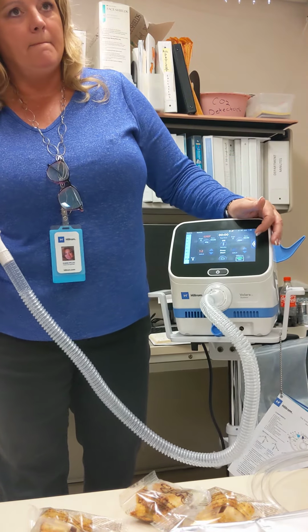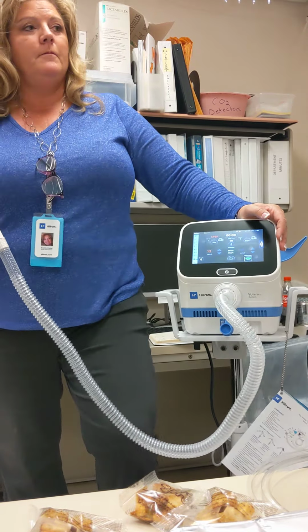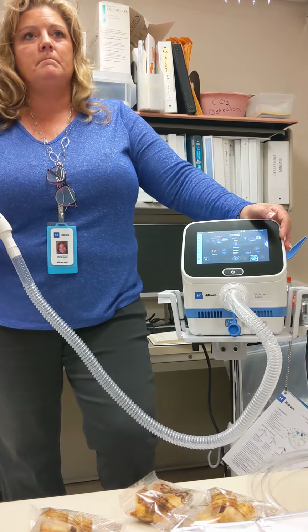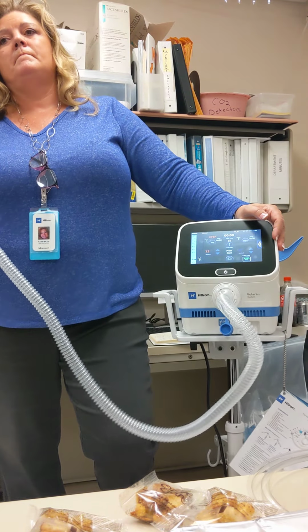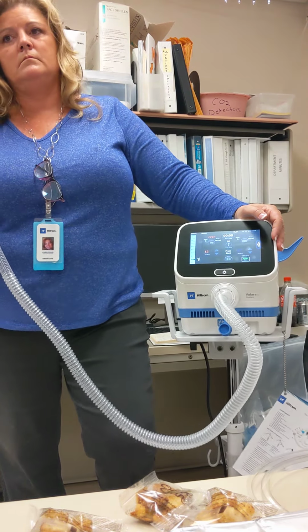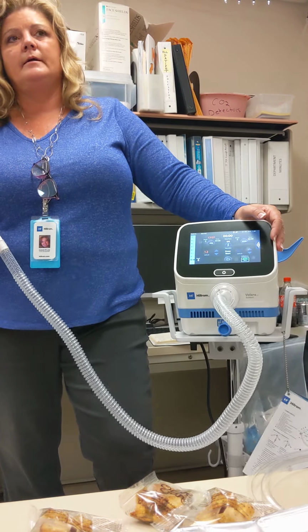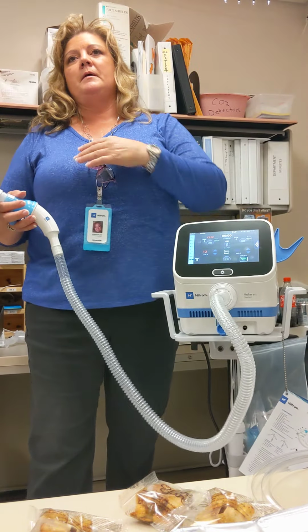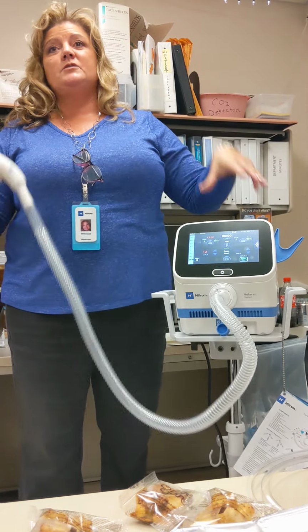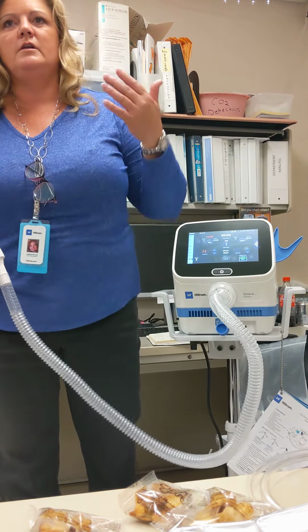What percentage do you suggest? Whatever you need, increasing to maintain the SAT. This is entraining room air, diluting the FiO2 delivered to the patient. We have to compensate. Because you're going to see the saturations drop for 2 reasons. One, because we're diluting air. And the other, mucus plugs. You're going to see that too.